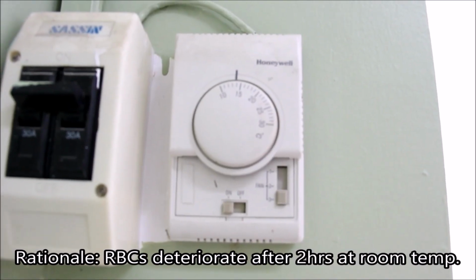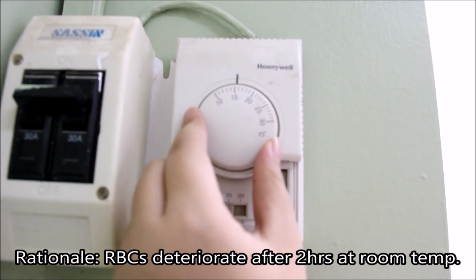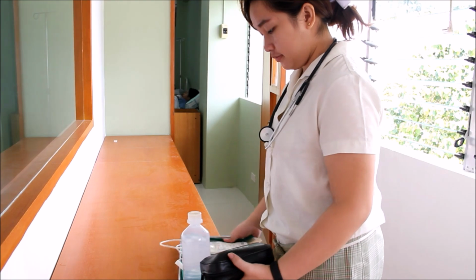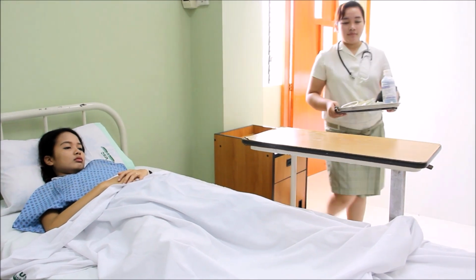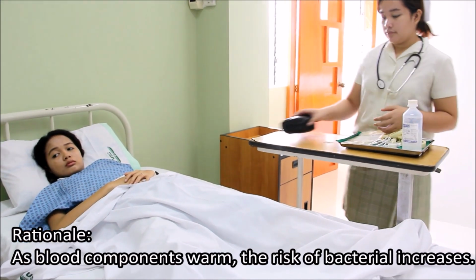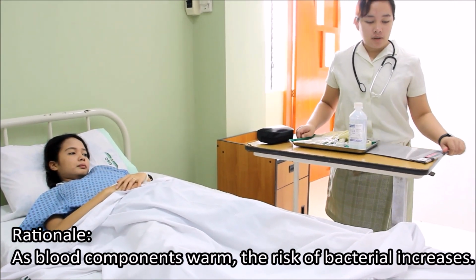Make sure that the blood is left at room temperature for no more than 30 minutes before starting the transfusion. Agencies may designate different times at which the blood must be returned to the blood bank if it has not been started. If the start of the transfusion is unexpectedly delayed, return the blood to the blood bank.